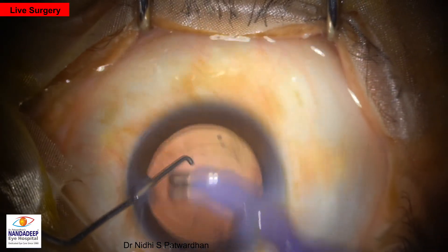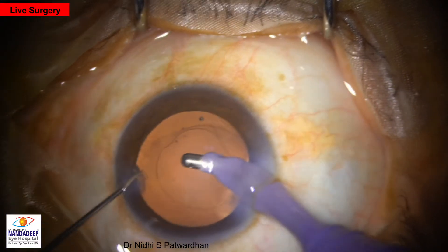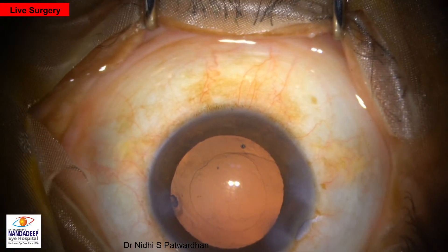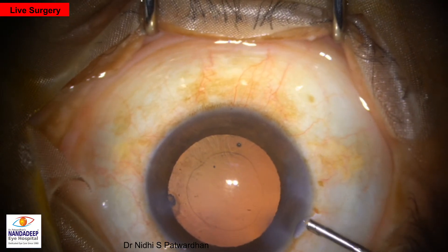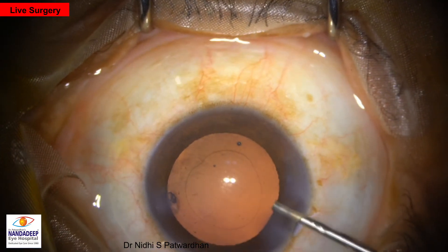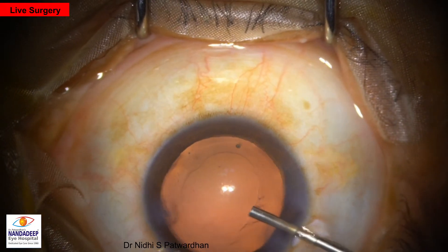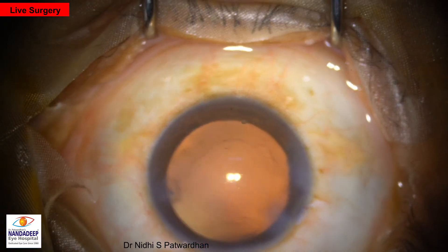We can do capsular polish. I generally do not do extensive anterior capsular polish because I feel that for the stabilization of the IOL, these anterior capsular cells are important — they fuse the anterior and posterior capsule and make it strong. Excessive anterior capsular polishing can lead to late subluxation.